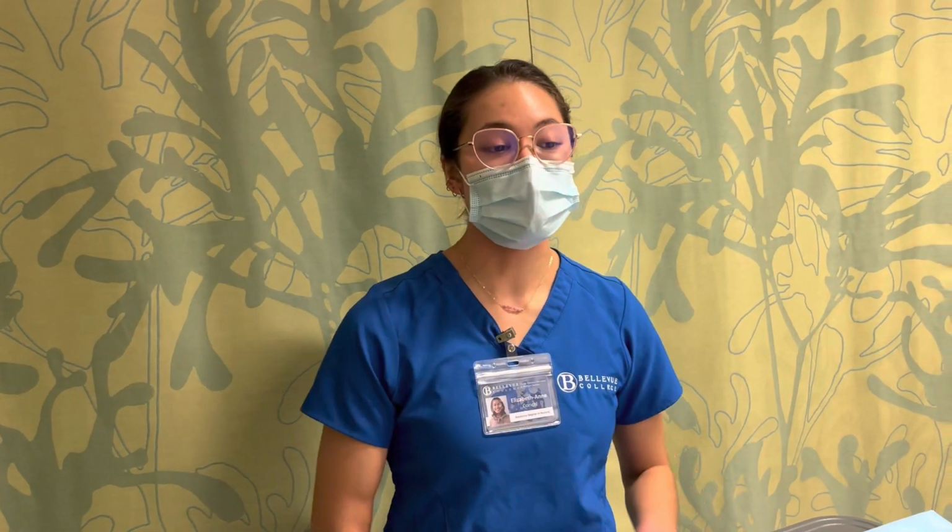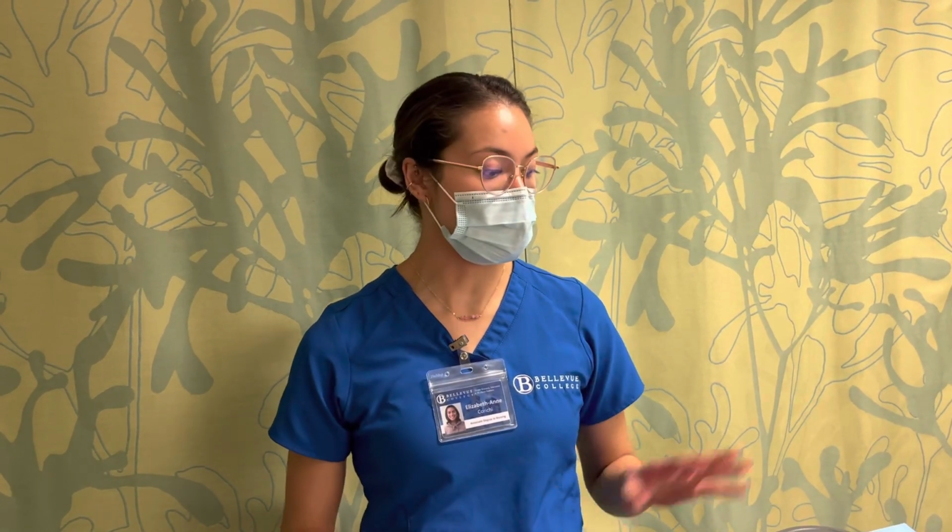Alrighty, so we are going to do a urinary catheter insertion for our patient. Previous to going in and doing the insertion, we've gone through the patient's chart. We've seen the order for the catheter that the provider has put in. So we have gone and gathered all of our correct materials. We've also made sure that the patient doesn't have any allergies to the materials that we're going to be using, as well as any contraindications, and we are all set to go there.